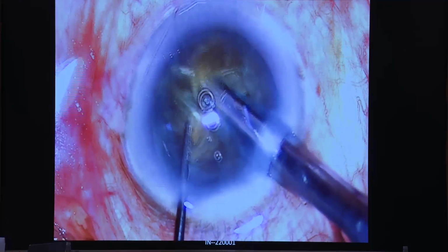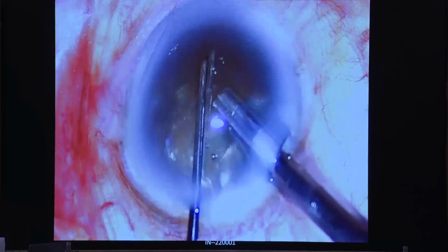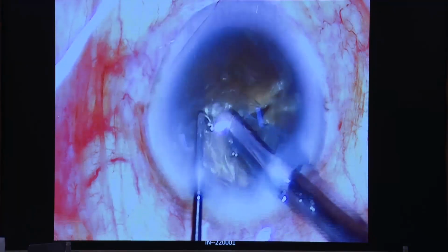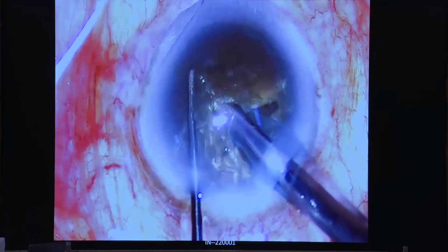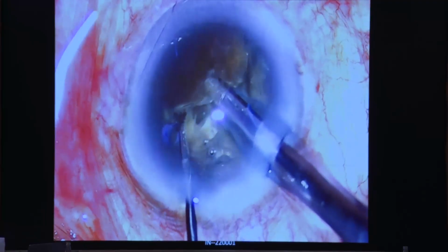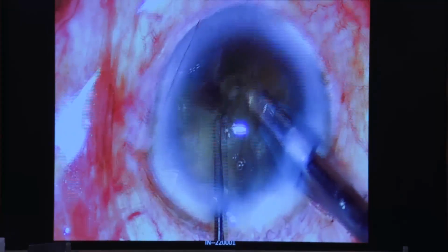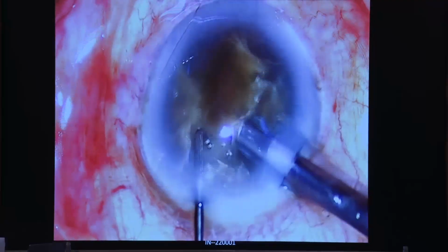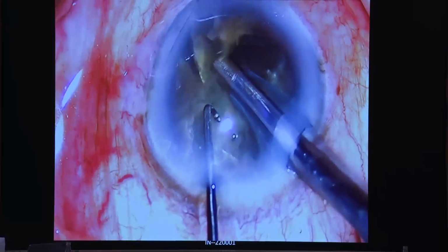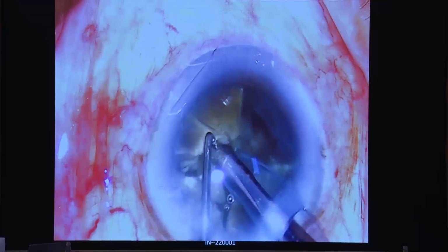Now this fracture is very important in these hard cataract. If you don't get the fracture of the nucleus, the whole surgery will become very difficult to complete, because these conjoined segments, and drawing these conjoined segments later on during the emulsification process would be very, very difficult. Now you see, this is how you get a complete fracture of these nuclei. And many times if you have these leathery brown nucleus, then you have to do a lateral separation force also to separate the nuclear fragments completely, because if you have a complete nuclear fragmentation, then hold these fragments softly and start emulsification.